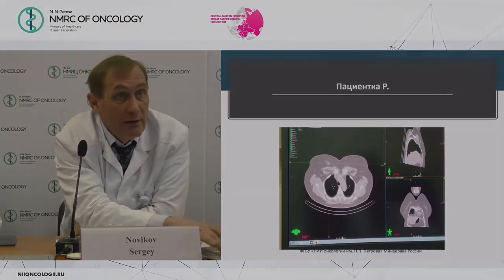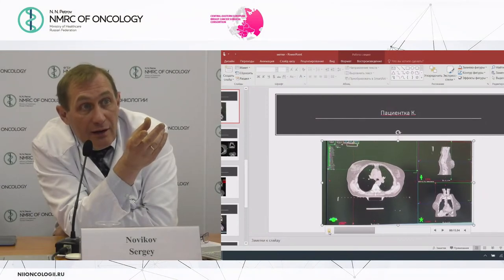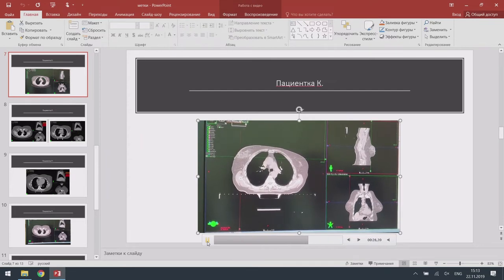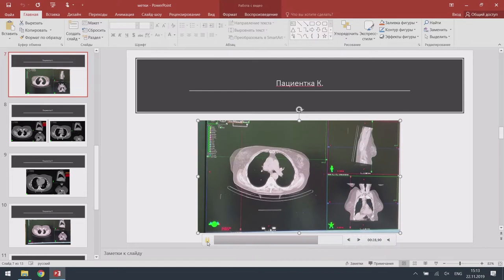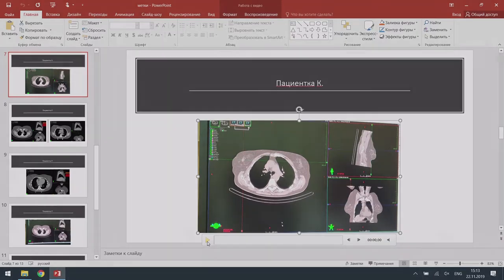And I think it would be possible now to show you. I'm not sure that it is this patient, but you see, we are trying to switch from one image to another. Now you see the tumor, and here you see the clips, which are located not completely, but a little bit not in the same position. They are much deeper, and it is some kind of mismatch between the position of the tumor and the position of the marks.